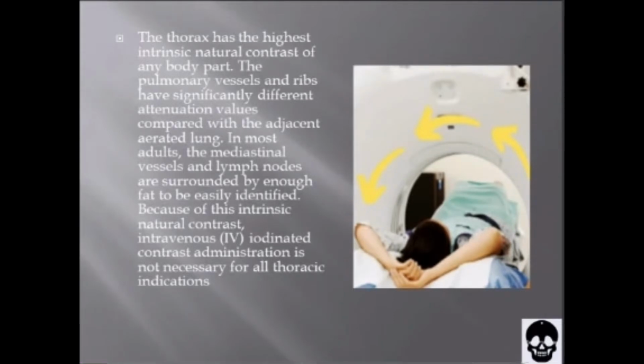Intravenous iodinated contrast administration is not necessary for all thoracic indications. For example, a scan done for screening, detection, or exclusion of pulmonary nodules or primary lung diseases such as emphysema or fibrosis is typically done without IV contrast administration.